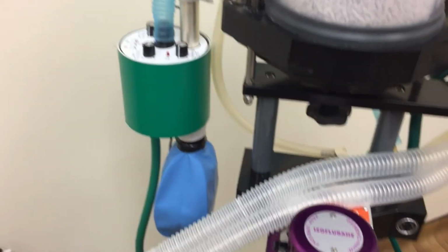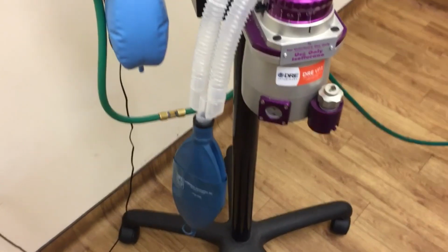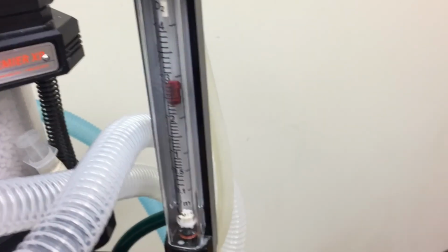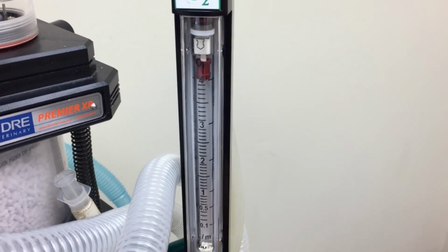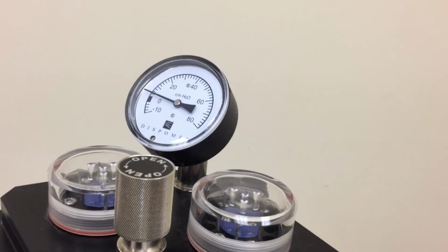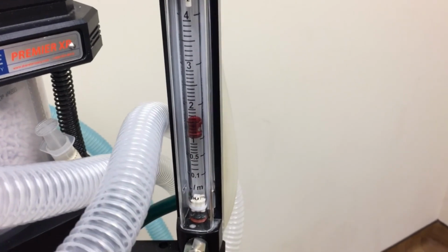A common cause for this, especially in dentistries, would be that the patient has disconnected from the system. The remedy for this, obviously, is to reconnect the patient and then turn the flow meter up to 3 or 4 or even higher liters per minute until the bag fills and the system restabilizes and comes back to normal. When this does, you can turn the flow meter back down to its normal 1.5 liters per minute.